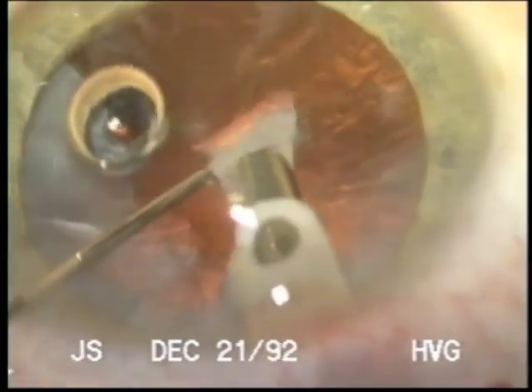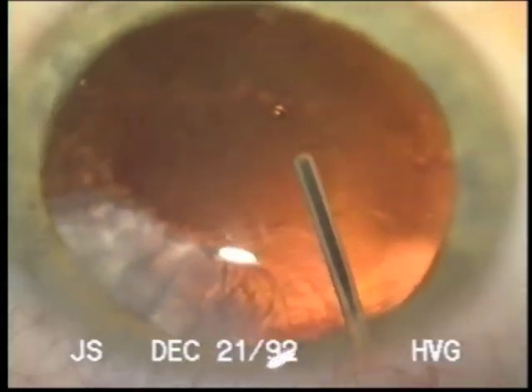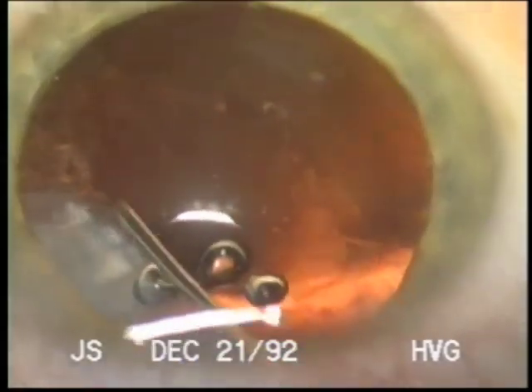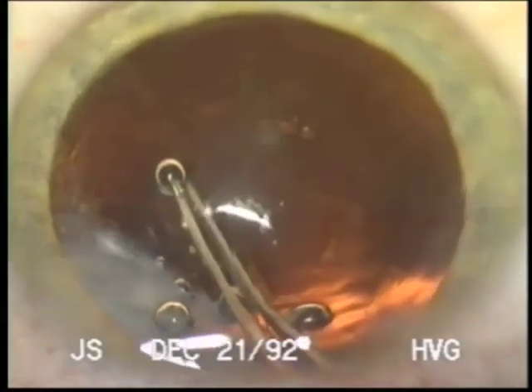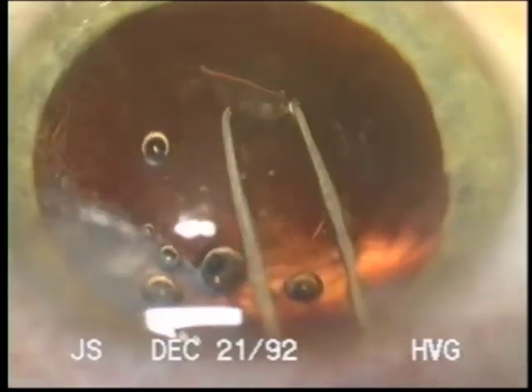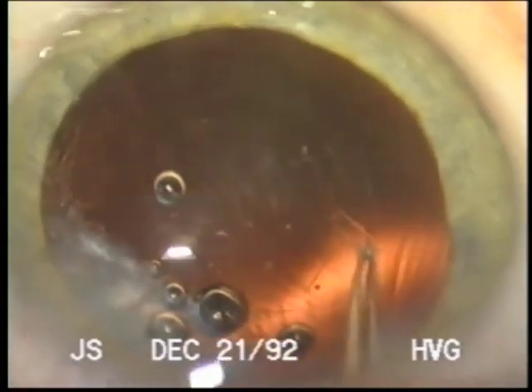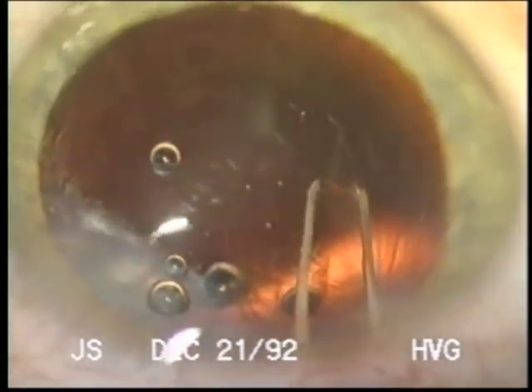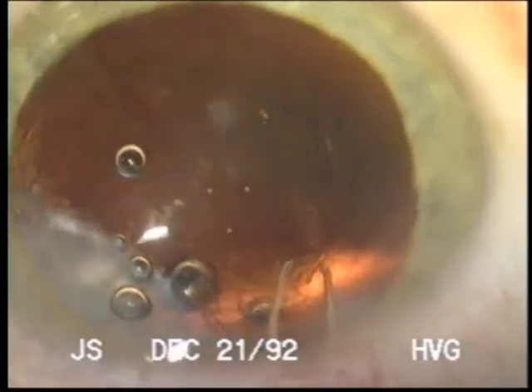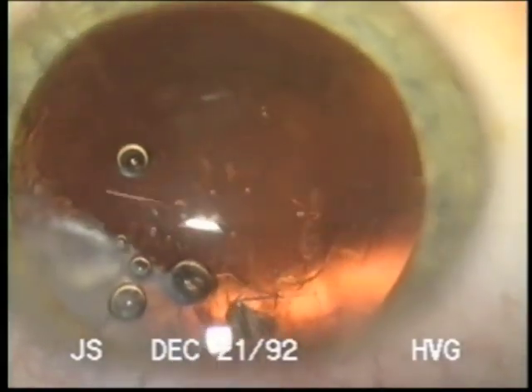Fortunately this lens broke up quite easily. And now with viscoelastic and a good red reflex we can convert this CCC by grasping one of the ends and tearing a continuous curvilinear capsulorexis around the can opener opening to achieve an intact capsulorexis opening.